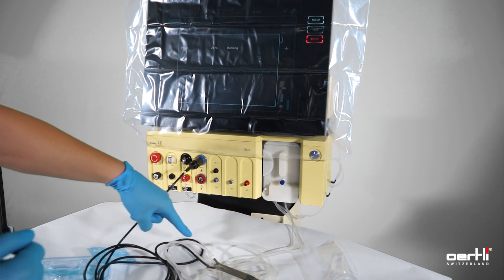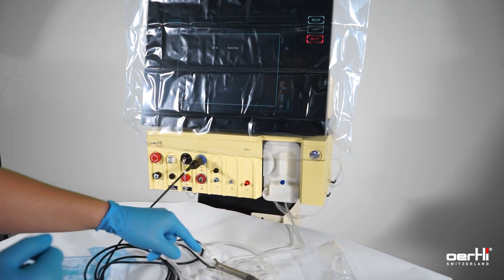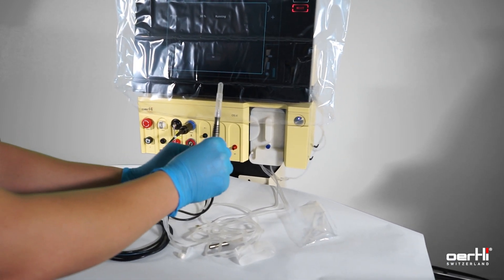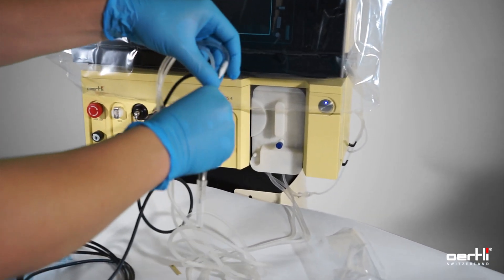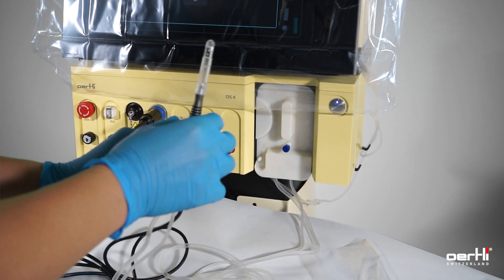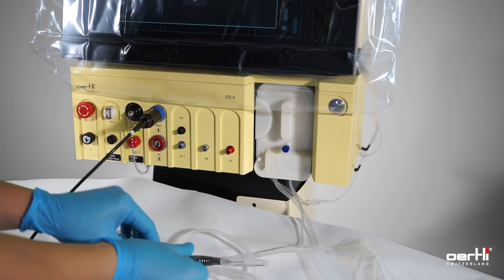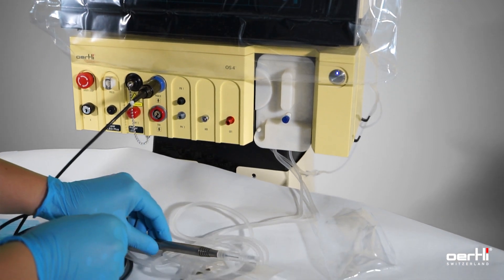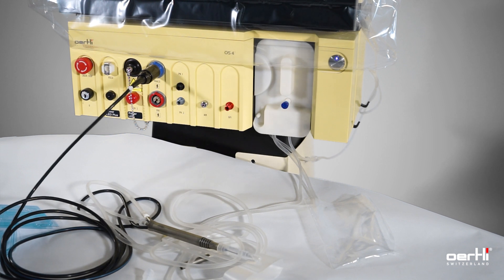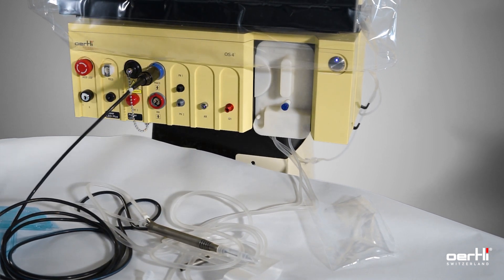And as soon as it reaches the handpiece, we highly suggest to grab the handpiece, aim upwards, downwards, upwards — remove the air bubbles — and lay it down on the table with it slightly tilted upwards and let the pre-op finish off.